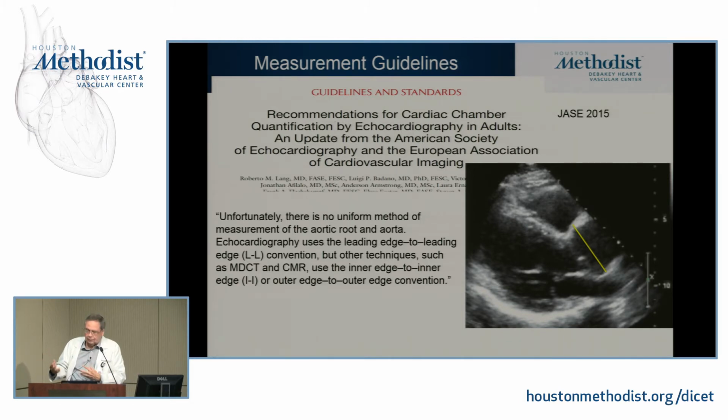And other techniques vary. So in this particular statement, they actually tried to get together for a convention, and they still had the struggle. So even though, from an echo point of view, leading edge to leading edge is recommended, I think when we are in our day-to-day practice with aneurysms, I personally like to go all the way out, because that's the one where I think we have more agreement.